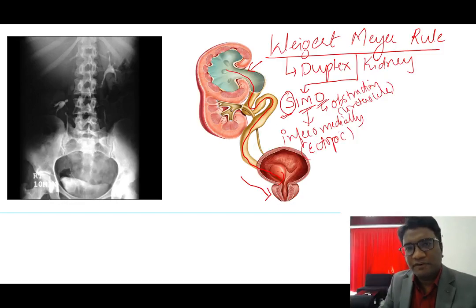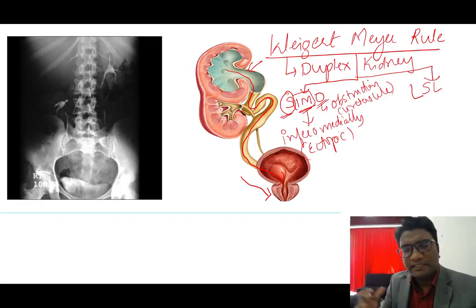And the opposite of it is also right. So if you look at the lower ureter, superior you can remember it as inferior, and infero-medial will become superolateral. The lower ureter will insert superolaterally, the normal insertion. It's a normal orthotopic insertion. The superior ureter will have ectopic insertion. The lower ureter will insert normally on the superolateral side of the bladder.